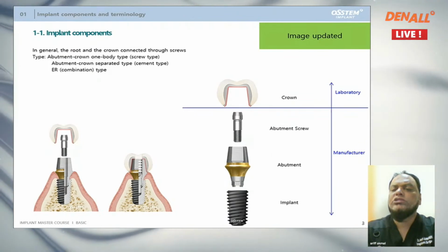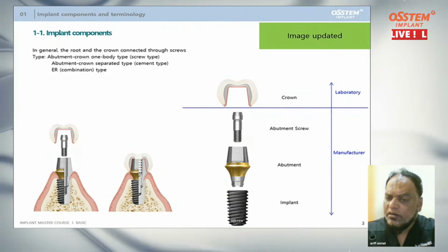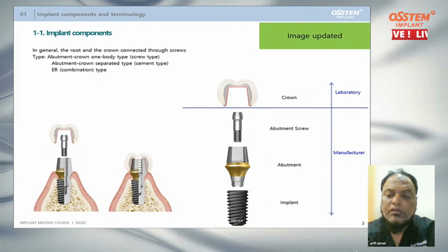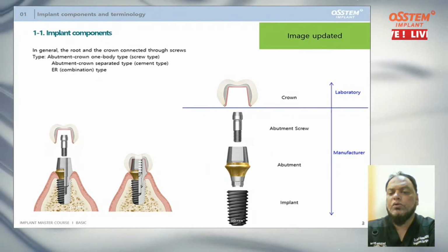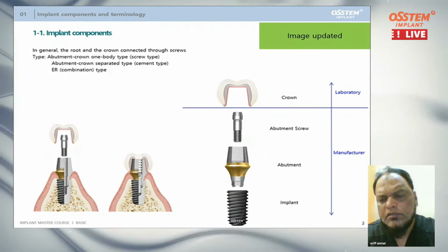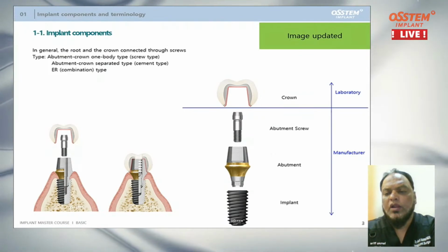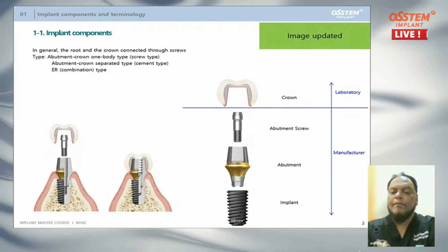And as you are all aware, if you want to do a root canal treatment, there are certain instruments which are required for that. Like you want to have an endomotor, you want the files, you want the broach, you want to have a plugger, you want GP points, you have to have a sealer. Something similar is there in implant dentistry as well. What are the basic instruments? There are some basic surgical instruments which are required.